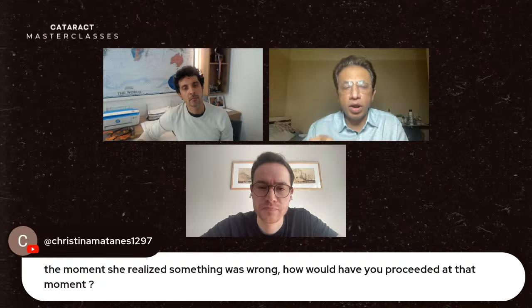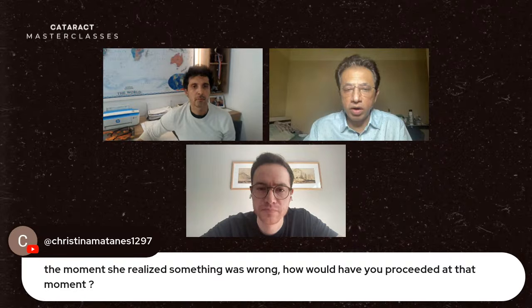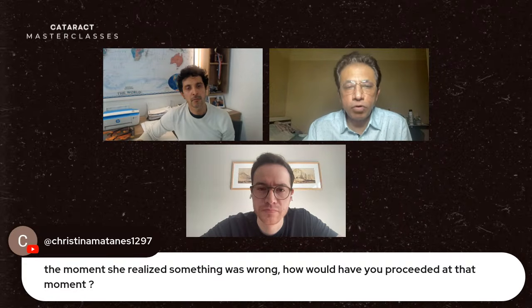If you're sitting temporal and doing, usually we recommend doing temporal phaco. If you're doing temporal, switch to the superior quadrant, create a fresh sclerocorneal tunnel, pull the nucleus out manually, and then see, rather than continuing. That would be my recommendation.